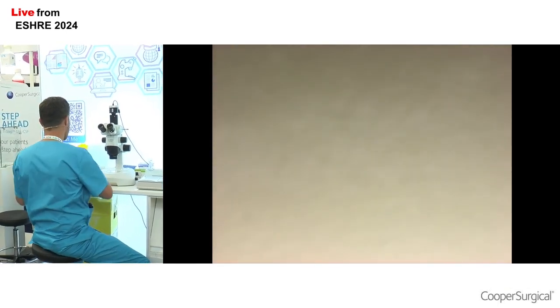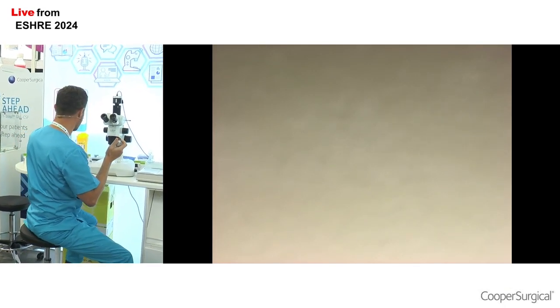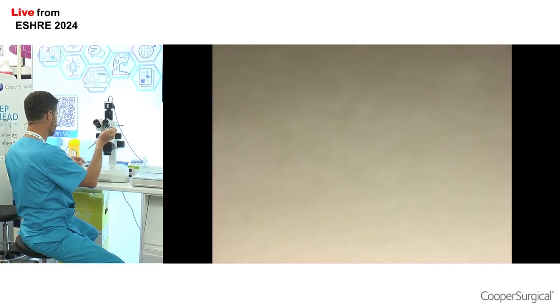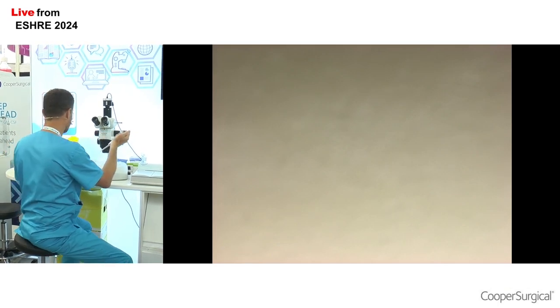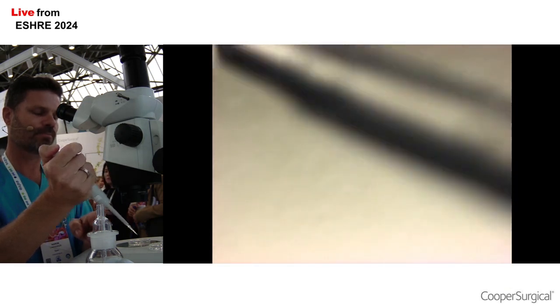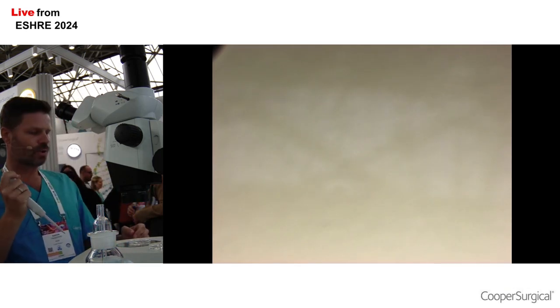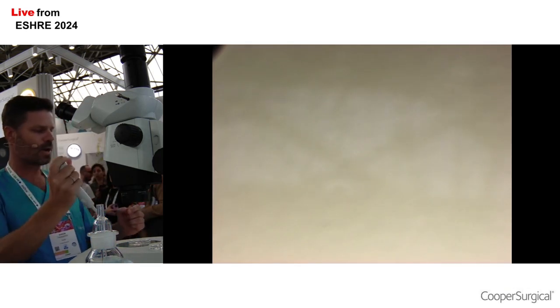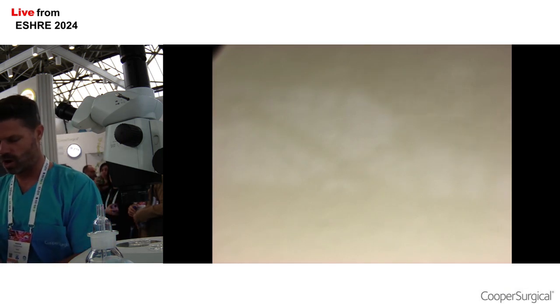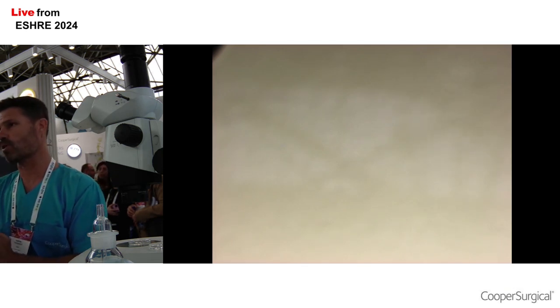What I'm going to do first of all, in the middle of the dish, is place a 10 microliter drop of, again, my HEPES or MOPS buffered media for using without CO2. Just 1 drop, in the middle of the dish, okay? Now I'm going to get 1 small drop of about 2 microliters of my sperm preparation. Of SpermSlow, the SpermSlow media.